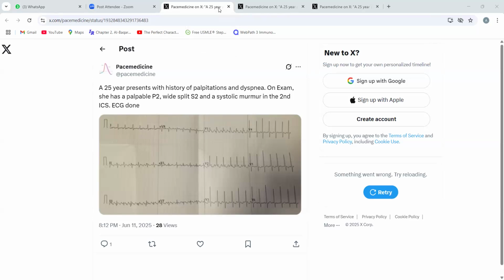So this is an ASD case. ASD patients present this way, and they have palpitations. This patient had right ventricular failure, because she developed dyspnea and right ventricular failure, and then she had this atrial flutter. And there's another question about MIs. You can answer that, and then we will give feedback on the questions, especially the one that is left, after the poll ends.